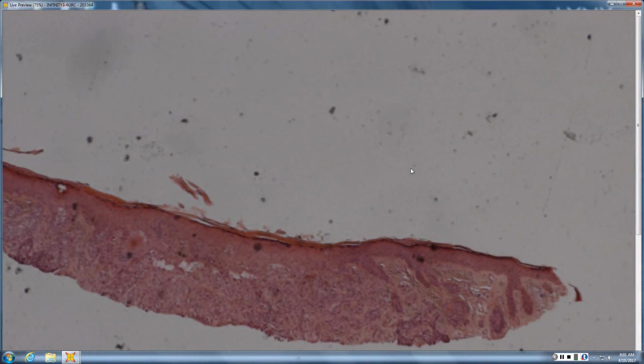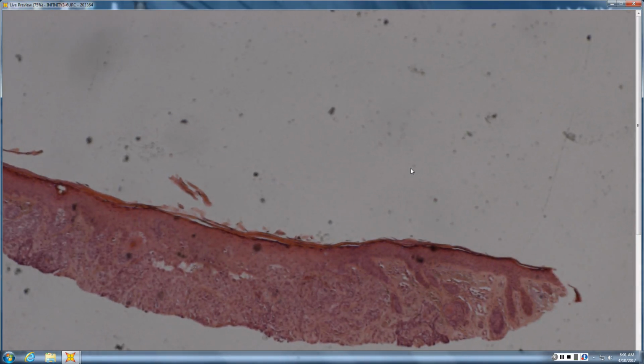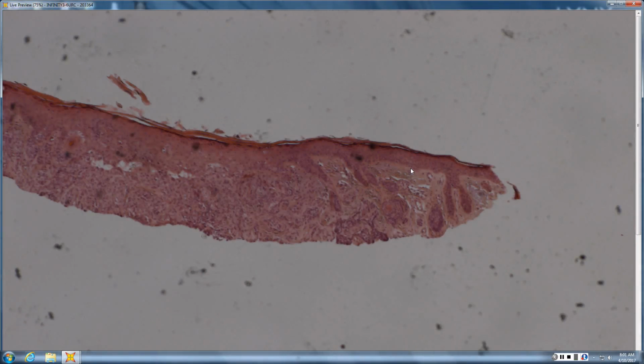Let's see, proliferation in the dermis. Pretty dense. I'm not sure this is like one of those spindles slamming up against the dermis. So, is it spindled here or more solid areas? There's some solid areas there. Blue or pink? Blue, so maybe like a retraction space and spiky. Yeah, it's maybe like an infiltrated BCC. Very good.